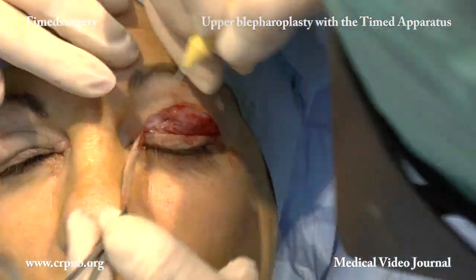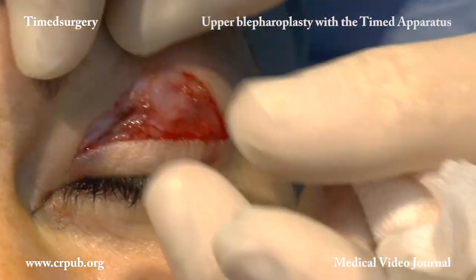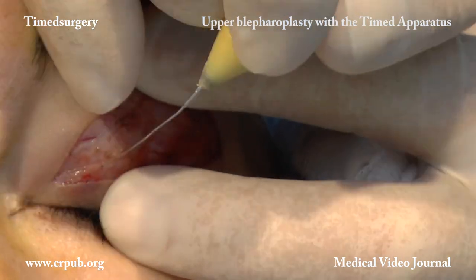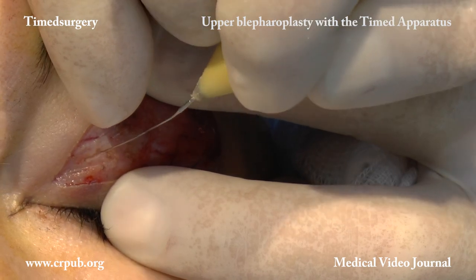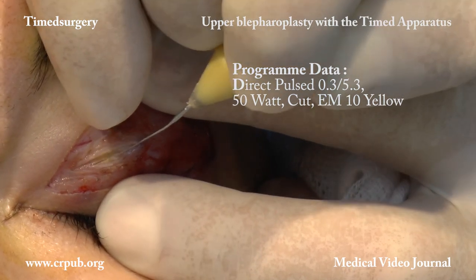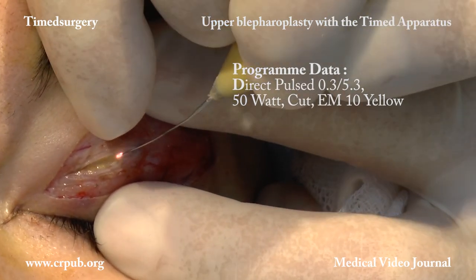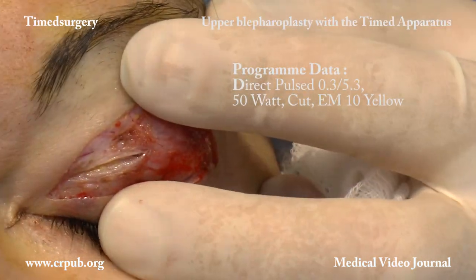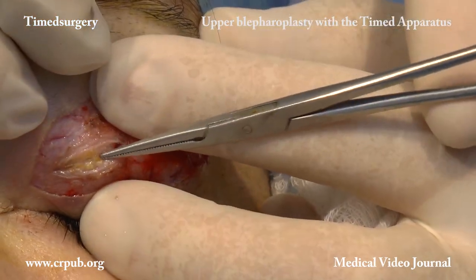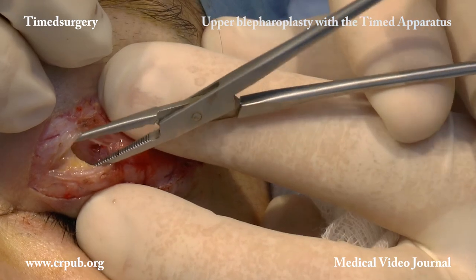On completion of the skin excision, the operator incises the orbital septum in order to remove the palpable fat, which, in small orbits, impairs the correct opening of the eyelids. After incising the septum, the operator uses a fine clemmer to grasp the fat and, by means of rapid pulsed cutting, frees it from the fasciae to which it is anchored.